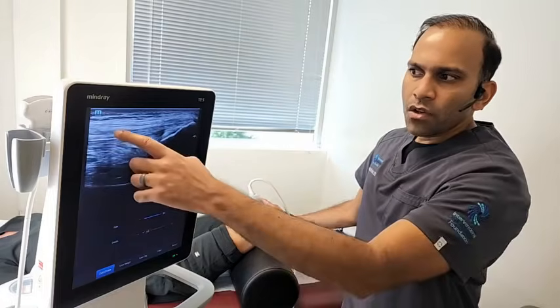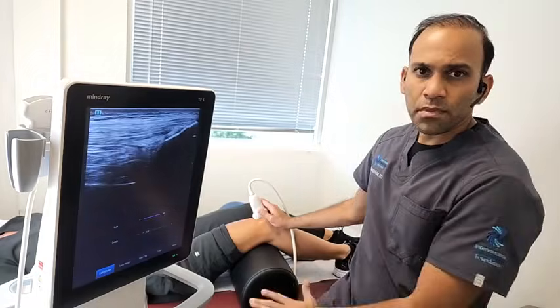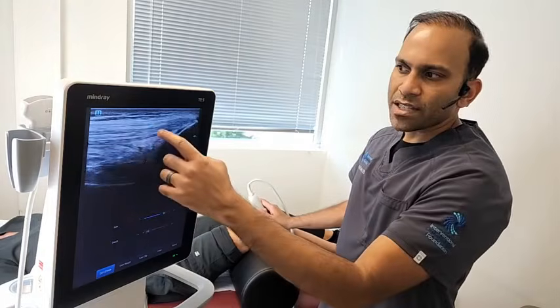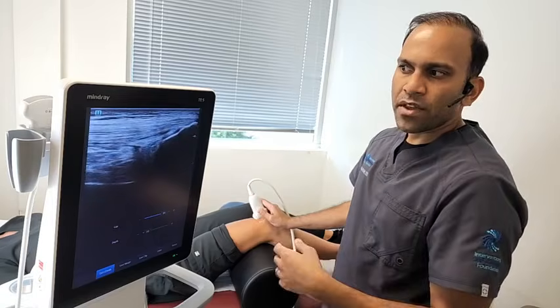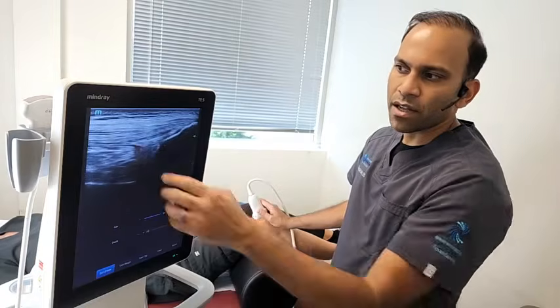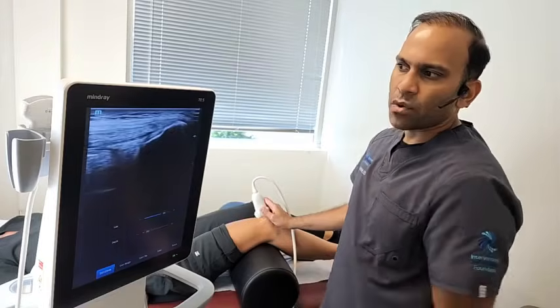Now, looking from this view, this is the tendon of the quadriceps muscle. The quadriceps is the big muscle in the front of the thigh. And the tendon is what attaches muscle to bone. And you can see the nice pattern of tendon here, kind of all lined up fibers. The way that I describe tendon is like the bristles of a paintbrush that are all compact, all parallel. And you can see that really quite well over here, coming and attaching all the way over to the kneecap.